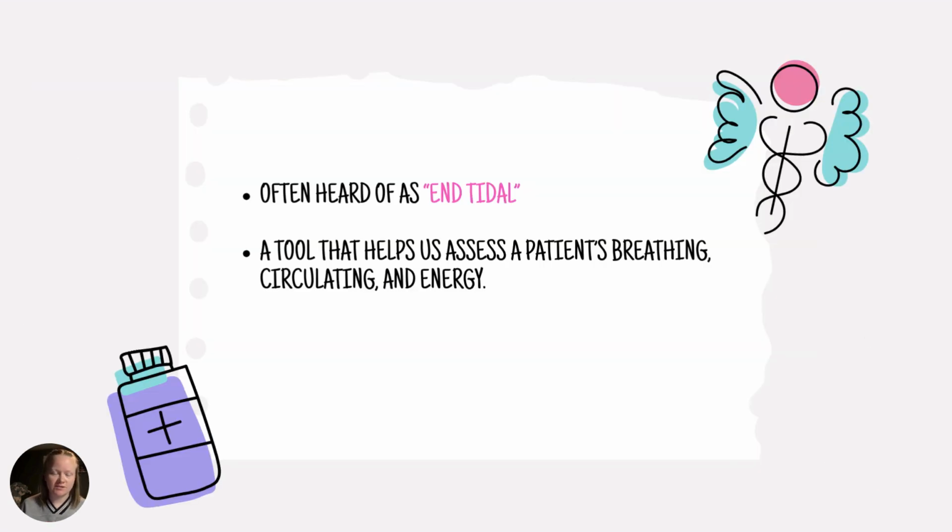Or as we often call it, end-tidal. Capnography is a tool that helps us see how a patient is breathing, how their blood is circulating, and even how their body is making energy.